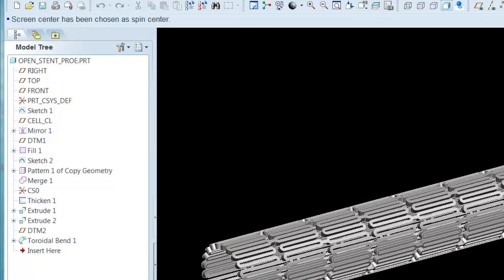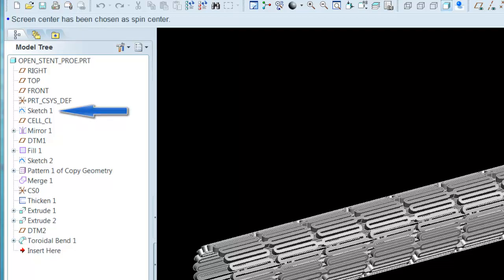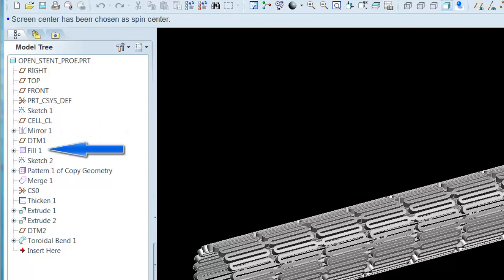Let's take a closer look at the way the Pro-E model was created by inspecting key items in the feature tree. After using the default datums, a planar curve is generated using a sketch datum curve. This defines half the geometry of the basic cell. The next key feature is a simple mirroring to create the second or anti-symmetric half of the basic cell. Next, a flat surface is generated referencing the curves of the basic cell.